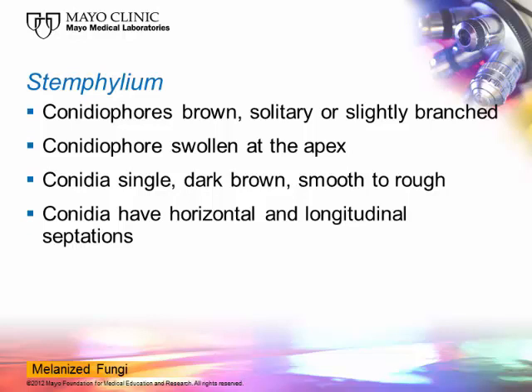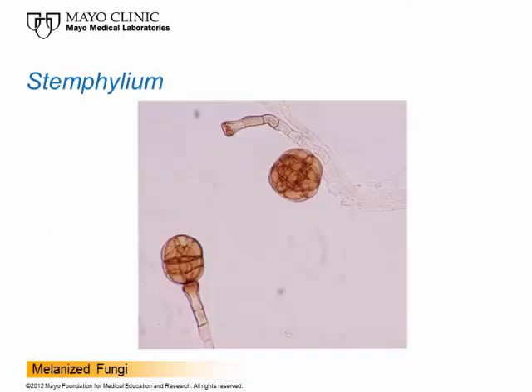Stemphylium will show us another example of a geniculate conidiophore. The conidiophores are brown, single or slightly branched, and the conidia are single, dark brown, smooth to rough, with horizontal and longitudinal septations. Someone described this organism as looking like a bale of hay on a long stalk. You can see a conidiophore with a big spore that has very obvious horizontal and longitudinal septations. The lower left cell is resting on top of a conidiophore that is swollen at the very tip. That is Stemphylium.